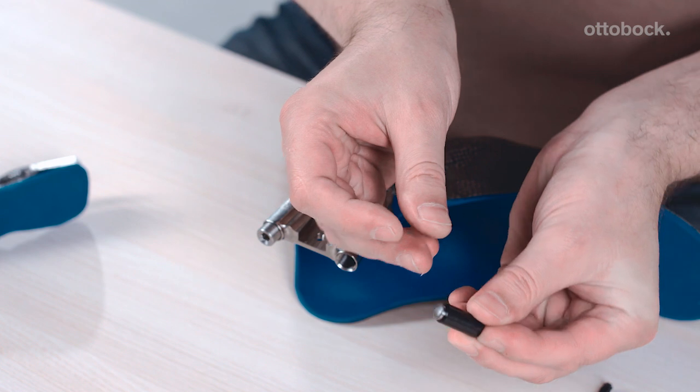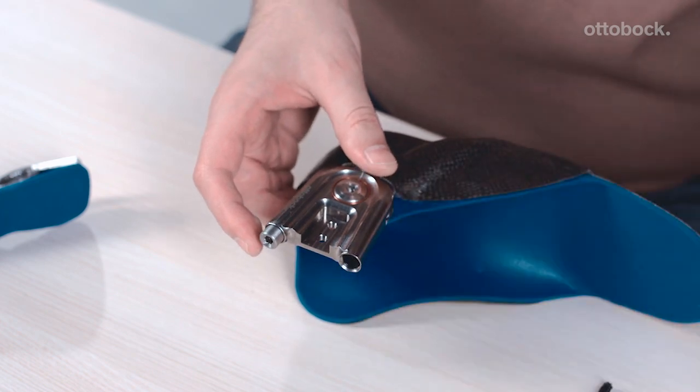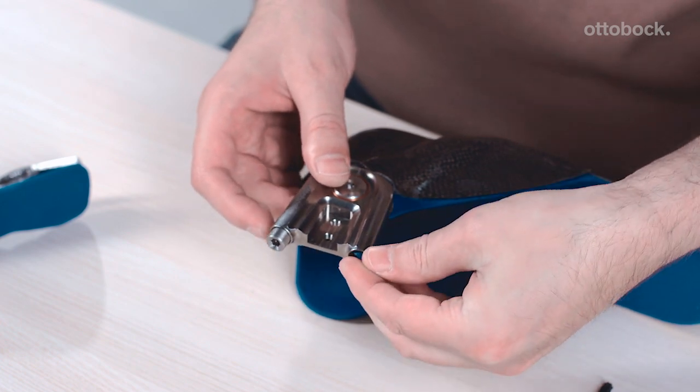Ensure that the tapered side of the stop is resting on the foot stirrup when installing the stop pin. Slide the stop pin into the stop sleeve and insert them into the basic piece together. Then install the blue stop bumper and screw in the set screw.